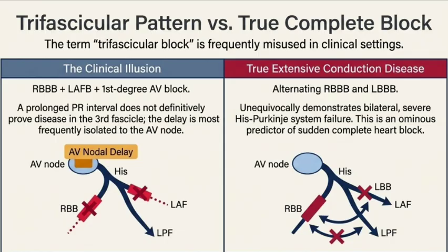Extremely rare. If a doctor does see an isolated LPFB on an ECG, a giant alarm bell goes off. Really? Because it tells them instantly that they aren't looking at a minor localized issue. They are looking at severe, widespread, diffuse pathology, something aggressive enough to overcome two separate redundant blood supplies.